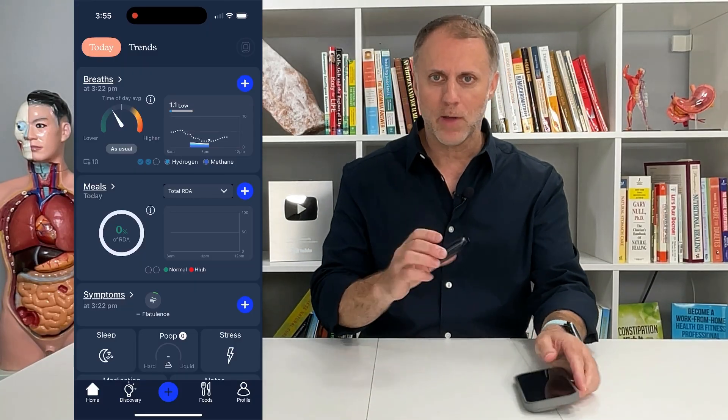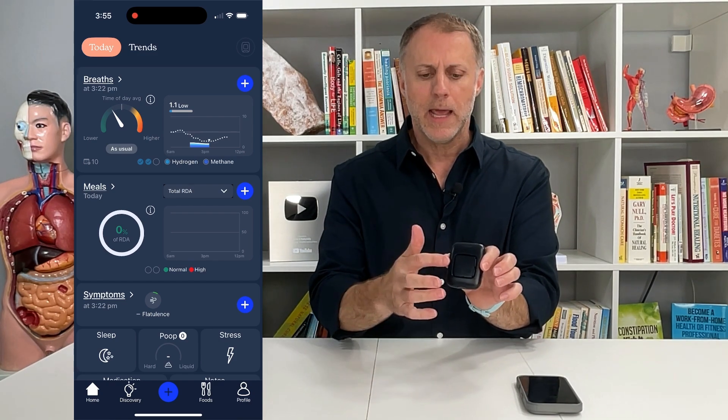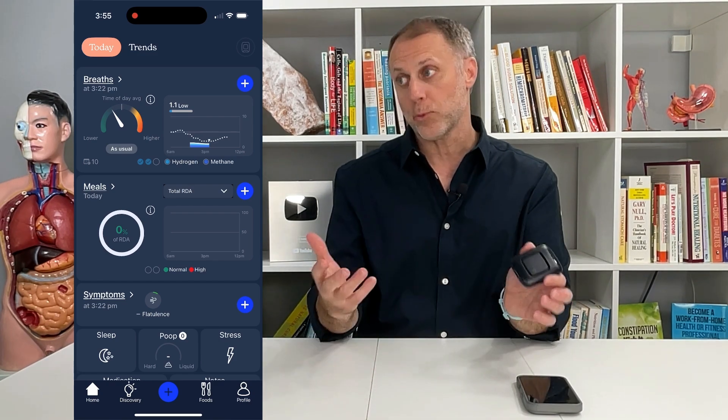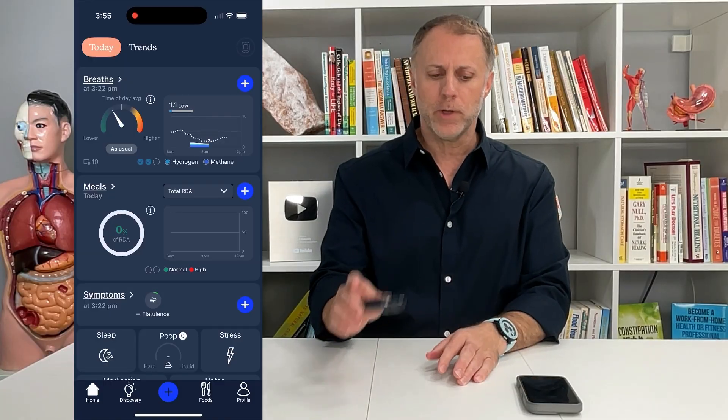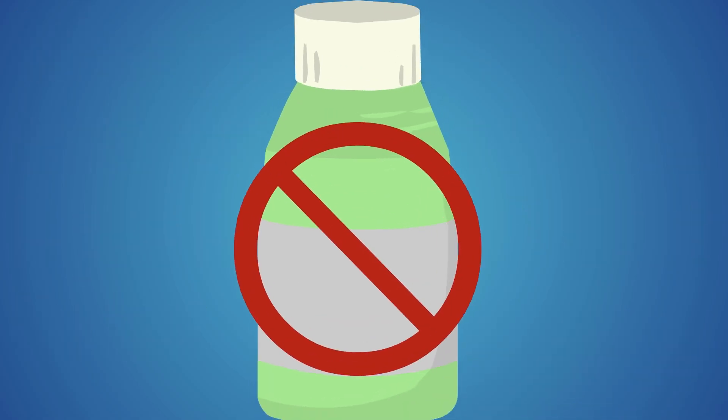We're just going to look at how to run this test. First, you double-tap it to turn it on, and then it takes a minute — sometimes three or four — to really warm up. Before you test, just make sure you've brushed your teeth so the bacteria in your mouth don't affect the test, but don't use mouthwash.